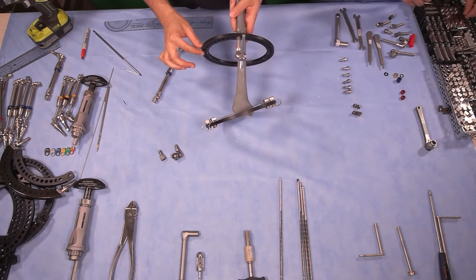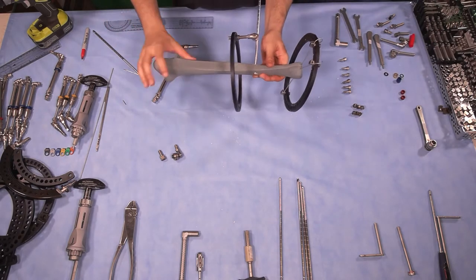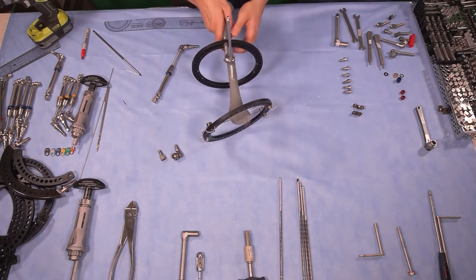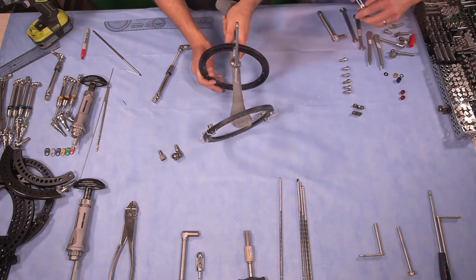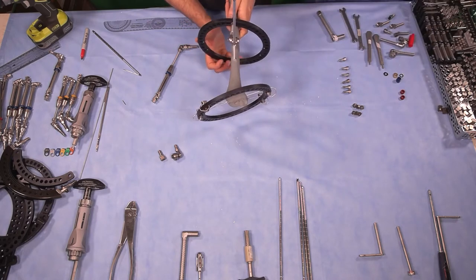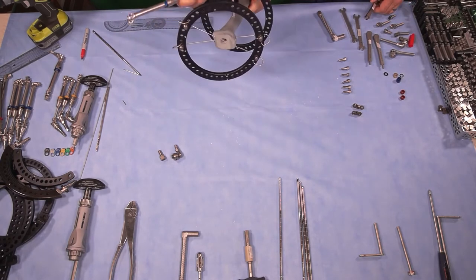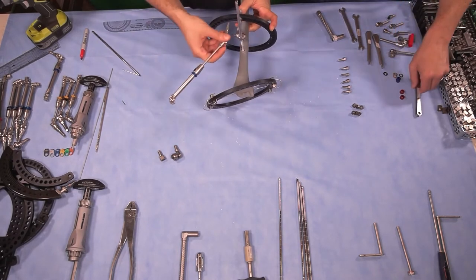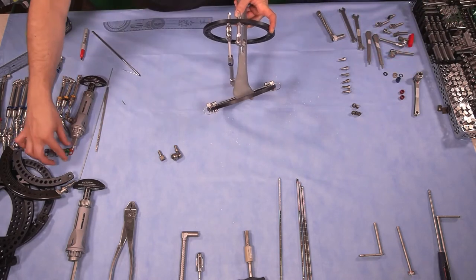To finish adjusting the ring orthogonal to the bone, we see that in the other plane it is not completely orthogonal — we adjust the swivel clamp slightly. If you leave it a little loose, you can attach your first telescopic strut, which must be slid in from the top. We add strut number one with its color-coded tab. This particular system shows the position of the struts with little geometric shapes on the ring.